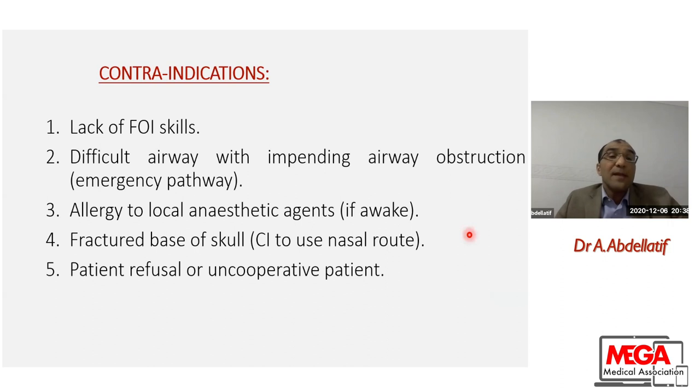The contraindications: the first one is lack of fiber optic skills. If there is difficult airway with impending airway obstruction, allergy to local anesthetic, if I'm going to use the fiber optic as awake, because I have to use local anesthetic first, fracture base of the skull, contraindicated to go with the nasal route, and if the patient is refusing or uncooperative.